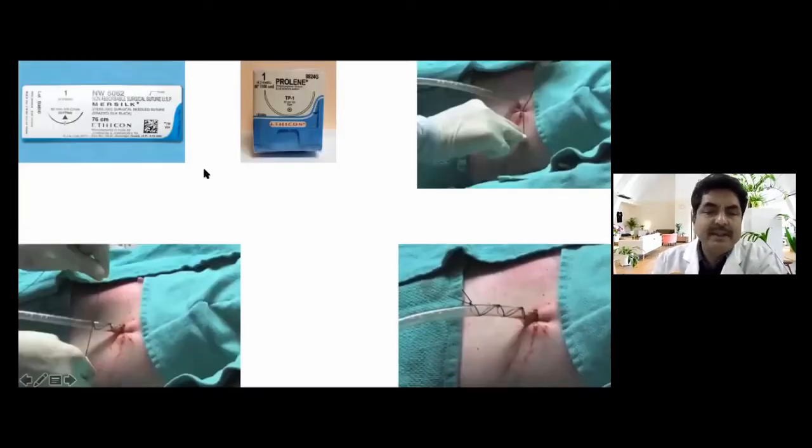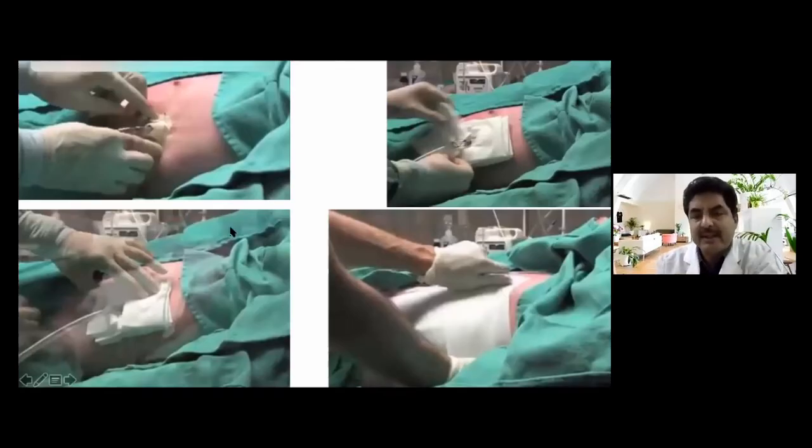This is not mandatory, but you can use it also. And how can you secure the tube? I told you earlier, you can use silk, or you can use Prolene number 1, which is the wider one. And you can use a 2-point or 4-point stitch in all layers, skin and subcutaneous fat. Make sure that there is no leakage around the tube. And you have to fix the tube like this or like this. But there is some other option. Somebody used to use the purse-string suture, so that you can tighten it later after the removal of the tube. But it is not always required. If you fix it like this, and if you remove the tube, a dressing pad is sufficient to control this port after the removal of the chest drain. Even then, it depends on the choice of the surgeon.